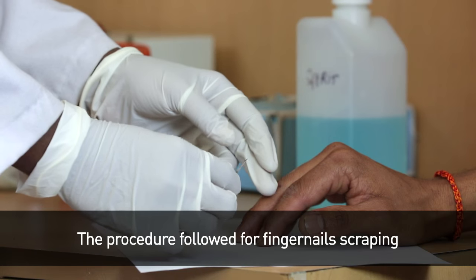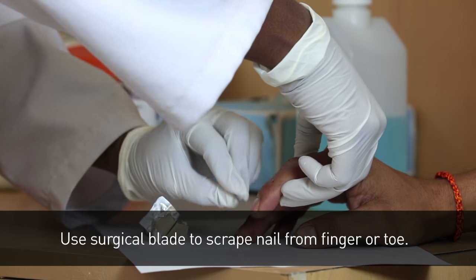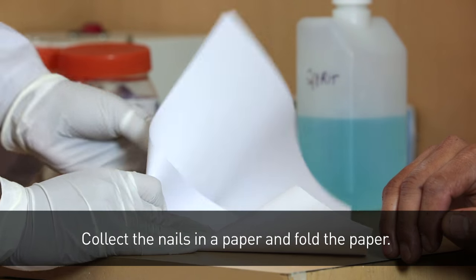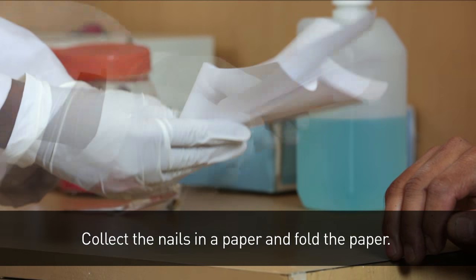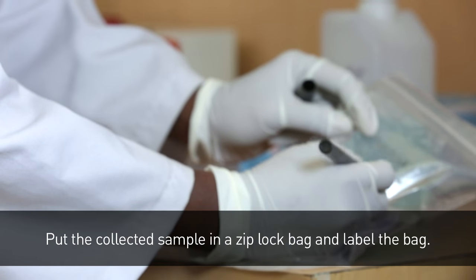The procedure followed for fingernail scraping. Use a surgical blade to scrape nail from finger or toe. Collect the nails in a paper and fold the paper. Put the collected sample in a ziplock bag and label the bag.